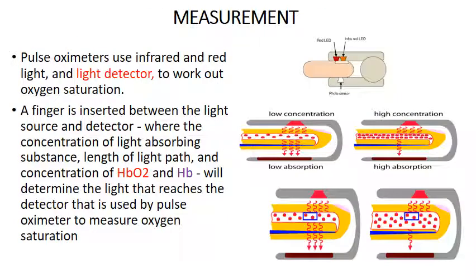So here's just a bit of review for you about how two different sources of light, red and infrared, are used to detect the amount of oxygenated hemoglobin in the blood, or that hemoglobin which is not oxygenated. And they have different absorption ratios in those two different wavelengths. And because the same photodiode is being used to detect both, this is what we talked about, the ratiometric design. If there's an error, the error occurs in both sensing modes, and so it cancels out. So that's the basis for determining in arterial blood the ratio of hemoglobin which has oxygen.